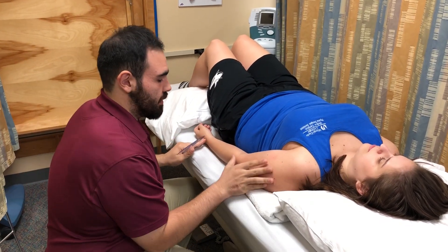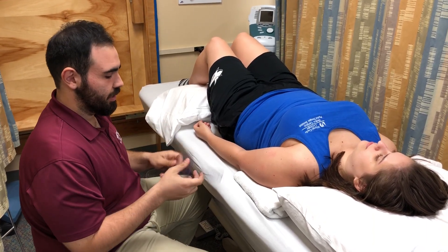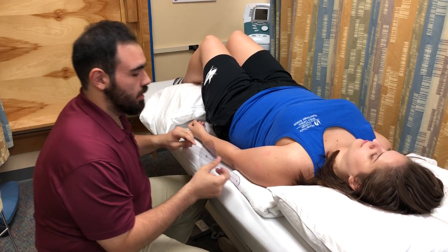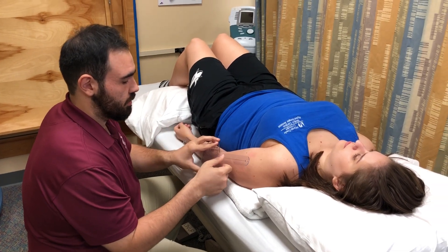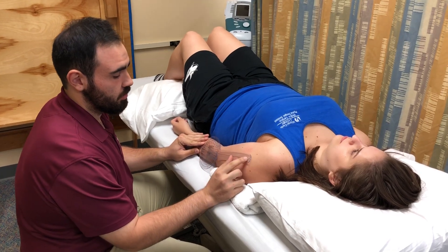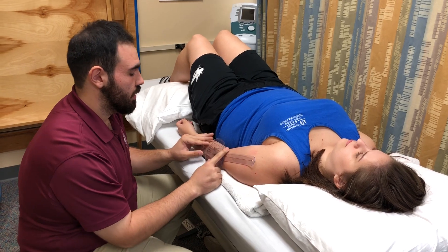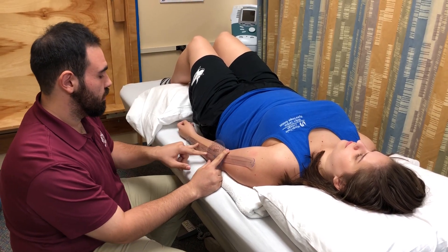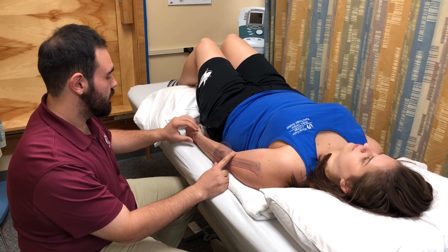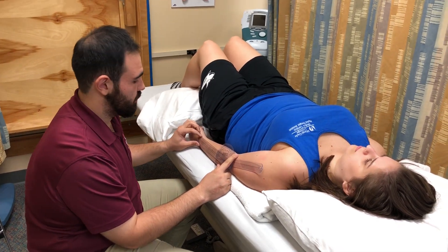I'm going to palpate the anatomical landmarks. The fulcrum of the goniometer is going to go over the lateral epicondyle. The proximal arm is going to be over the lateral aspect of the humerus and I'm going to be using the acromium as the reference point. And the distal arm is going to be along the lateral aspect of the radius and I'm going to be using the radial styloid process as my reference point.